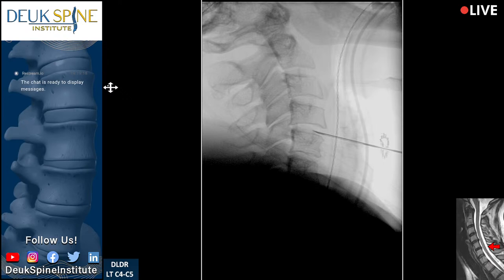I'm going to advance this. Perfect — we are now inside the C4-5 disc. Let's count: two, three, four, five. The disc we're in is the four-five disc, and that is the disc on MRI that has the herniation that's causing her pain and symptoms. We're going to do a discogram now.